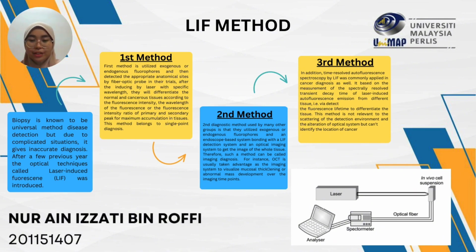Today I will present about the laser-induced fluorescence method, the LIF method. Biopsy is known to be a universal method of disease detection, but due to complicated situations, it can give inaccurate diagnosis. In previous years, the optical technique called laser-induced fluorescence (LIF) was introduced.